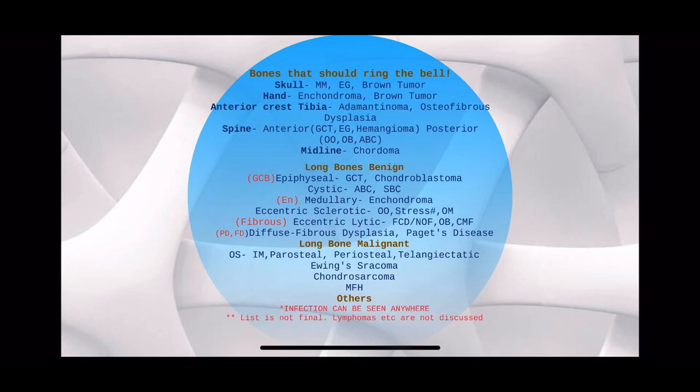Infection can be seen anywhere — in any bone, in epiphyses, in metaphyses — so it has not been mentioned specifically. This list covers the most common lesions asked in the exam.